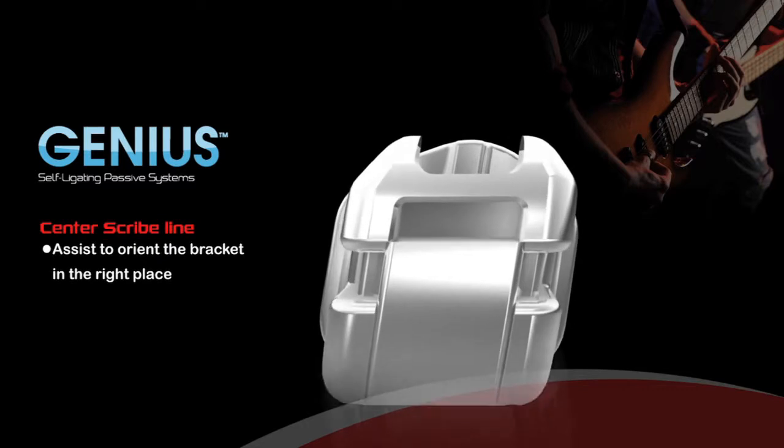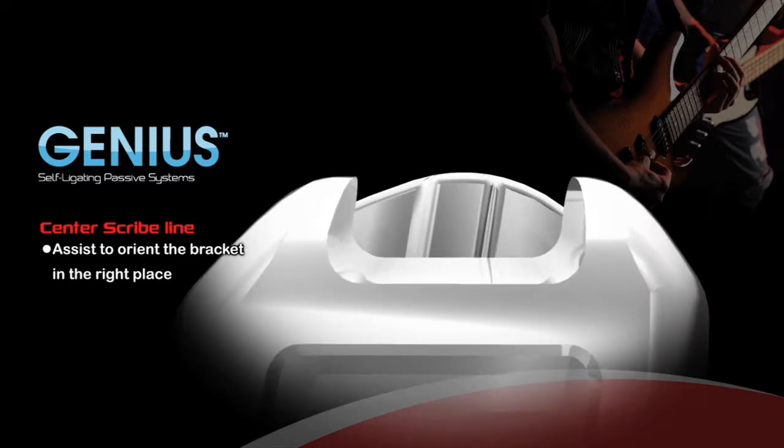Center Scribe Line: For proper bracket placement, Genius comes with a permanent center scribe line that provides a convenient reference for orthodontists to orient the bracket in the right place.